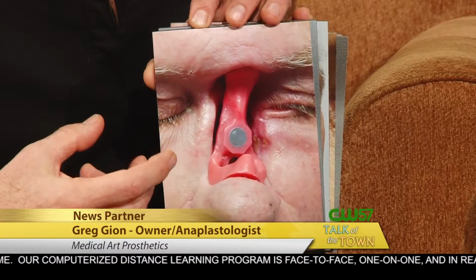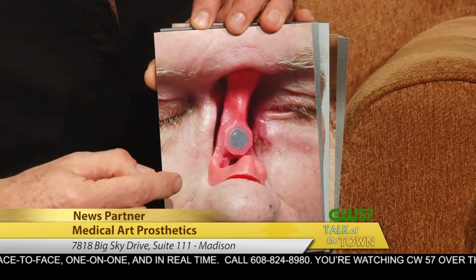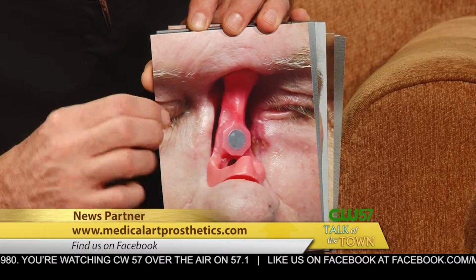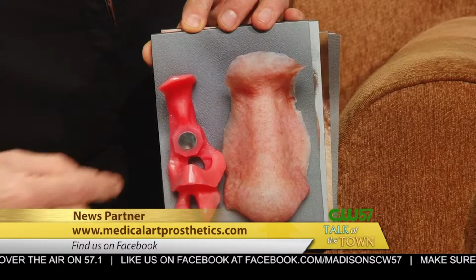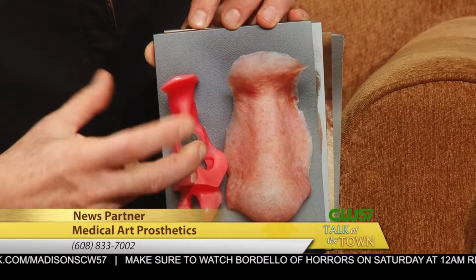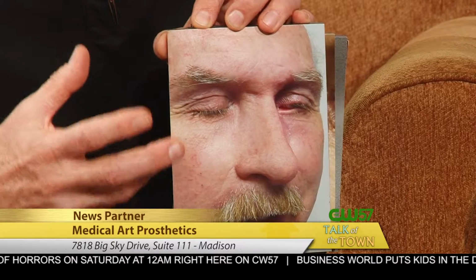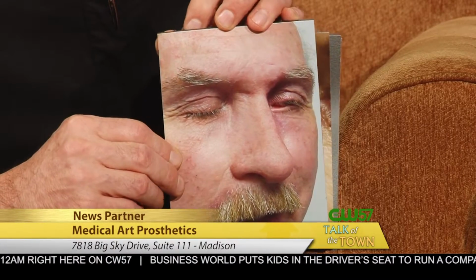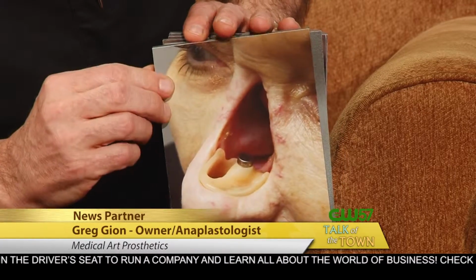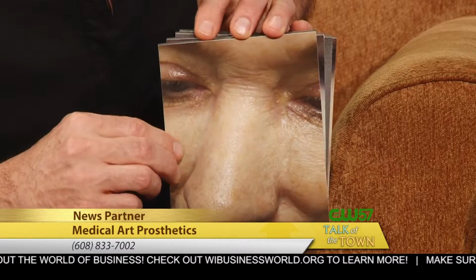The final basic method, which I really enjoy doing, doesn't require any surgery, and it doesn't require adhesive. What we call an intermediate or a retentive piece is designed to fit into the cavity with a magnet in it. You can see the 2 components here, the retentive piece and then the prosthesis itself, and those will click together. So once the person puts their prosthesis on, they have a nice retentive prosthesis and they don't need adhesive. A picture's worth a million words here. And this is just another example of the same kind of approach, a slightly different design of the 2 pieces. But again, you get the same kind of result.